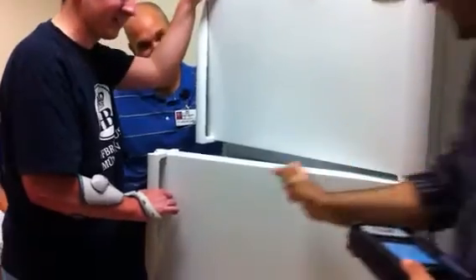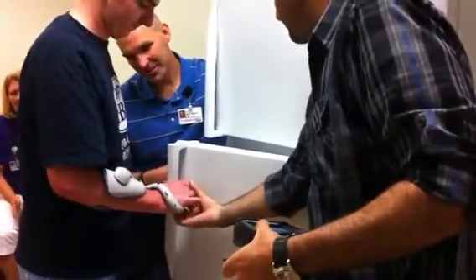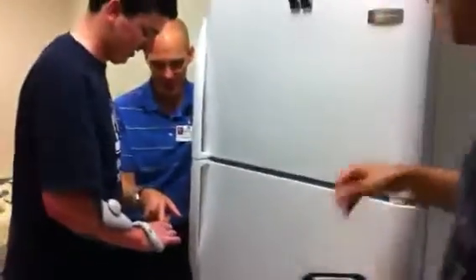So now you let it open now. So now it's in the open so you can... That's cool. Very cool. That looks nice right there.